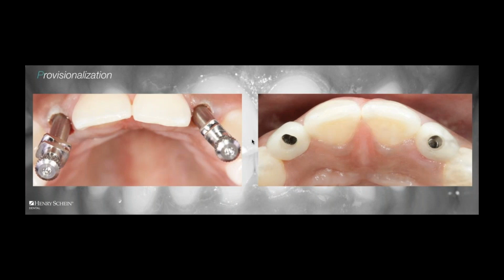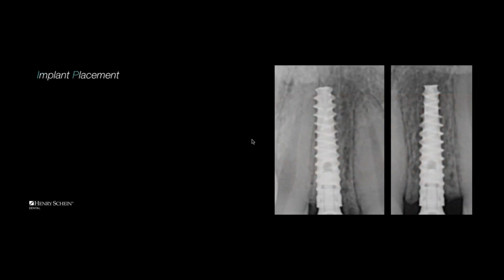We've been cementing crowns on zirconia abutments on dental implants since the 90s, okay? Nearly 30 years. But let's take a closer look. And when we look on radiograph, we start to notice a couple of things. First off, if you look at where the head of the implants are with respect to the adjacent CEJs, we know from our perio literature that the appropriate position should be ideally 3 to 4 millimeters apical to the adjacent CEJ. The literature actually supports that the head of the implant should be placed approximately 3 millimeters apical to the proposed zenith of the free gingival margin.